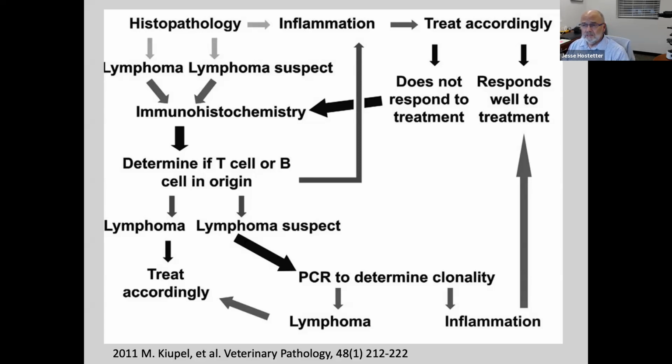Once in a while, though, I see it with fluid. You'll have fluid in that pocket, at least an eosinophilic fluid, and then you have to scratch your head and think, could this really be an acute epithelial injury? So, a hard question to answer, and a very good one.